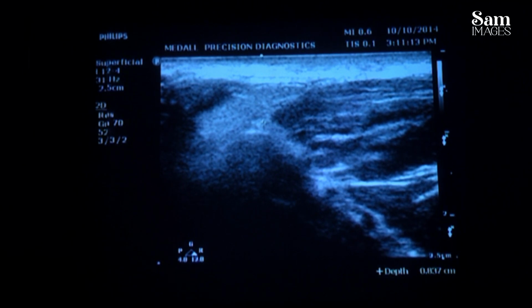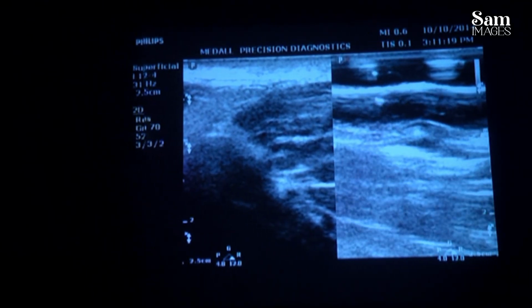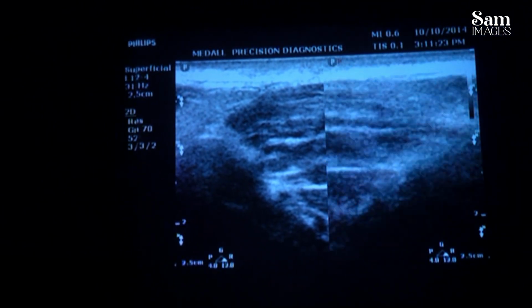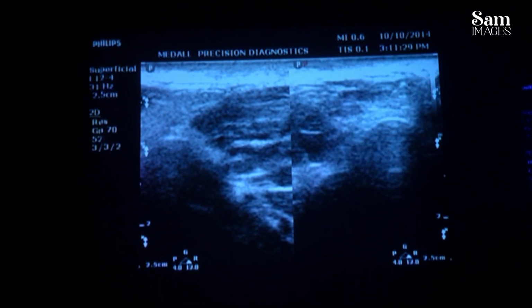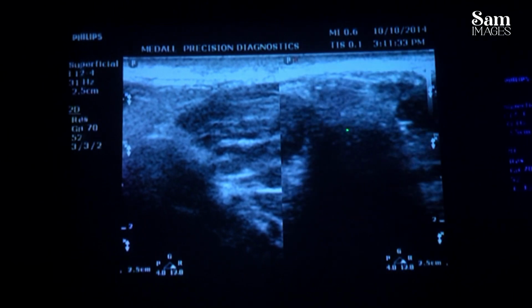Similarly, sometimes you put a split screen. For the opposite side, pull the tragus to the one side and then keep the transducer. You have to see this, that white one, that is the mandible. So you can see the movement.